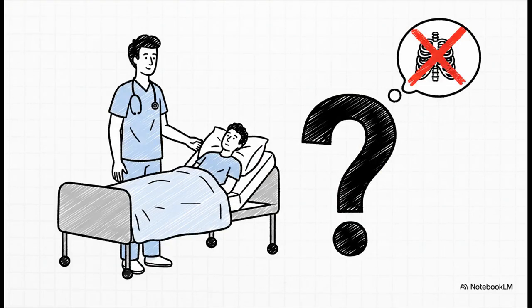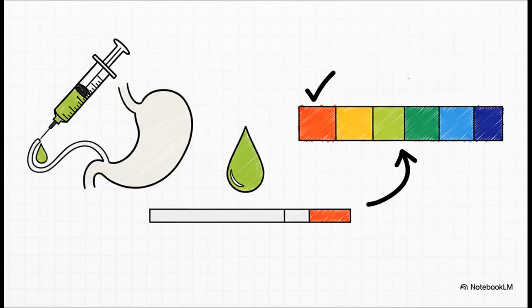But let's be realistic. You can't run down for an X-ray every single time you need to check the tube. So what's the next best thing? What's the safest and most reliable check you can do right there at the patient's bedside? That's where a little bit of science comes in handy.